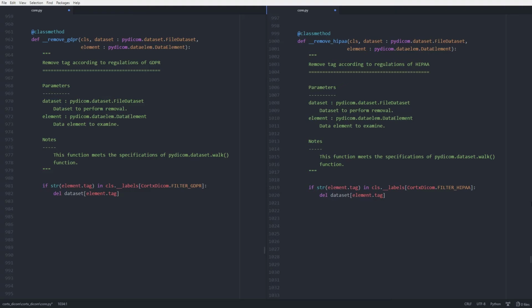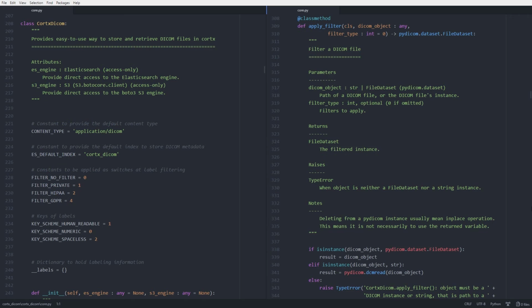Our solution can help users to identify potential legal and data risks, such as patient name, social number. We can remove protected health information from DICOM files to support HIPAA, GDPR, or CCPA compatible data management.